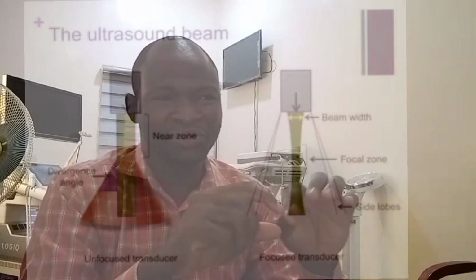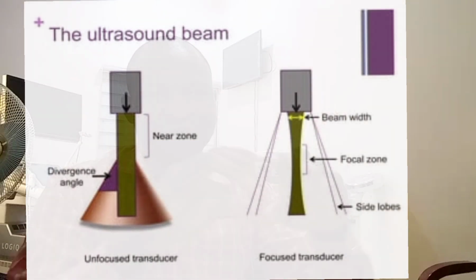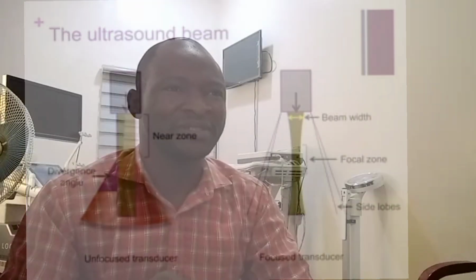That's to say, in the far field, small diameter crystals will result in a wider beam diameter. As the transducer diameter increases, the beam divergence decreases. As the transducer diameter decreases, the beam divergence in the far field increases. This sketch shows you the diameter and beam divergence to help you understand.